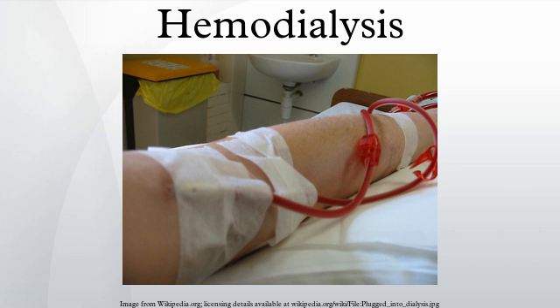Initially it is filtered and temperature adjusted and its pH is corrected by adding an acid or base. Then it is softened. Next, the water is run through a tank containing activated charcoal to absorb organic contaminants. Primary purification is then done by forcing water through a membrane with very tiny pores, a so-called reverse osmosis membrane. This lets the water pass, but holds back even very small solutes such as electrolytes. Final removal of leftover electrolytes is done by passing the water through a tank with ion exchange resins, which remove any leftover anions or cations and replace them with hydroxyl and hydrogen molecules, respectively, leaving ultra-pure water.